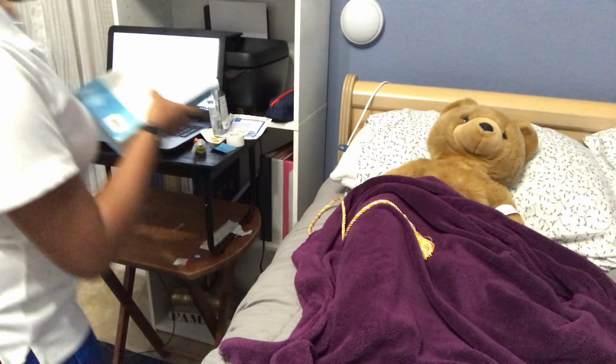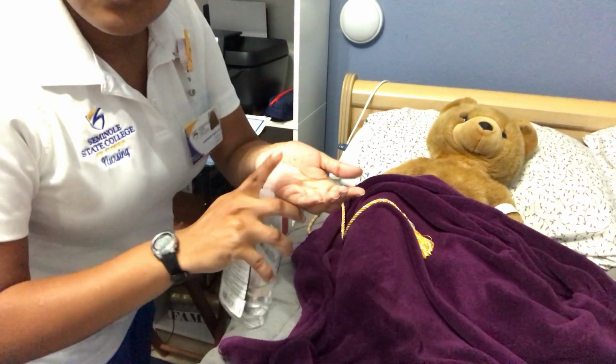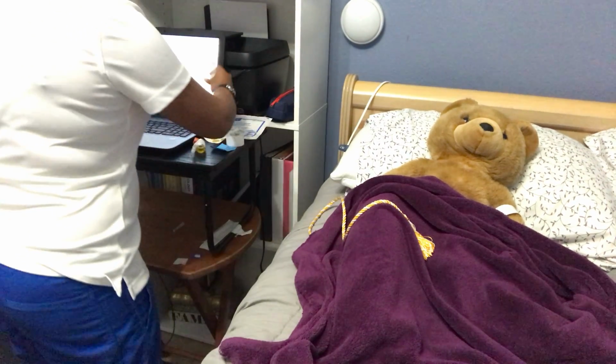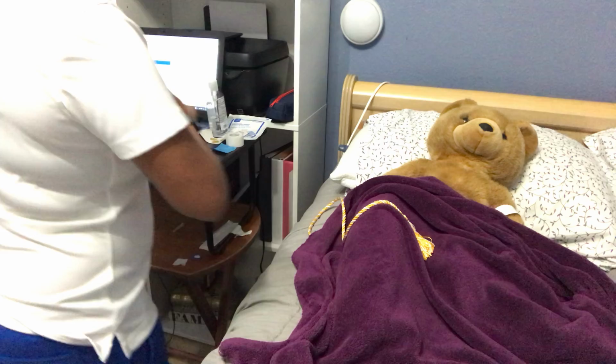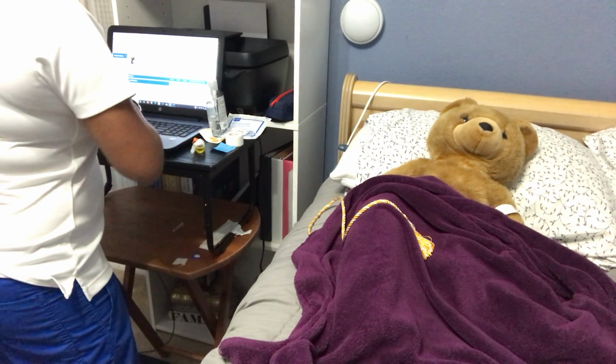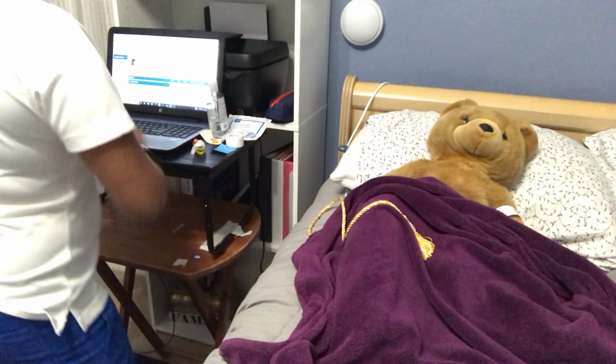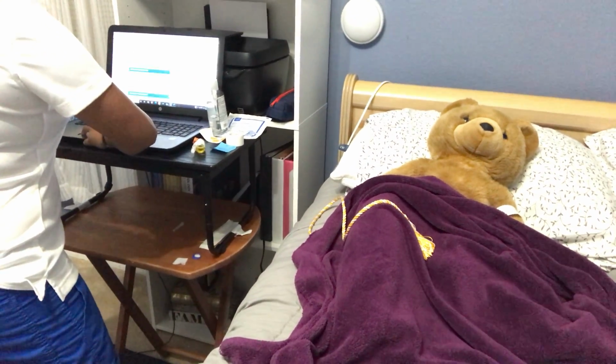Okay. Alright, so next I'm going to do the patient's 5 rights again. I'm going to clean my hands again. Alright, so the patient's name is Oscar Simpson. I'm going to look at your ID bracelet here, okay? All right. Now I'm going to look at the medication. So it's a medium dose.